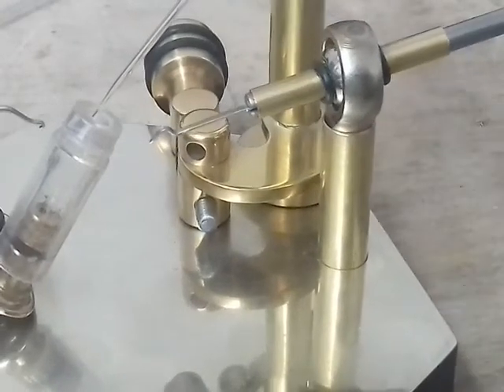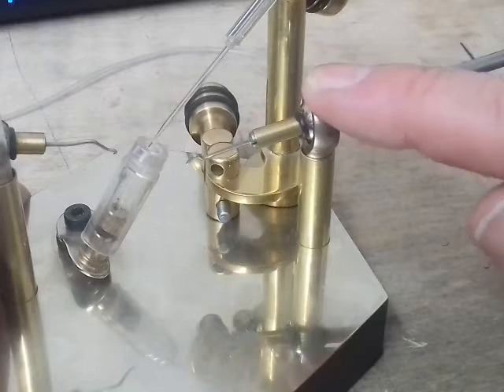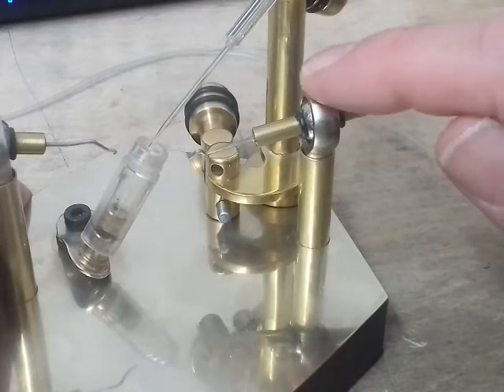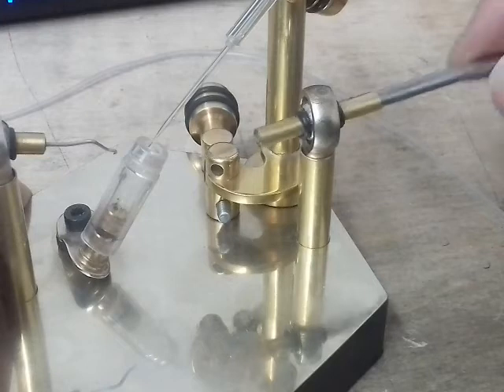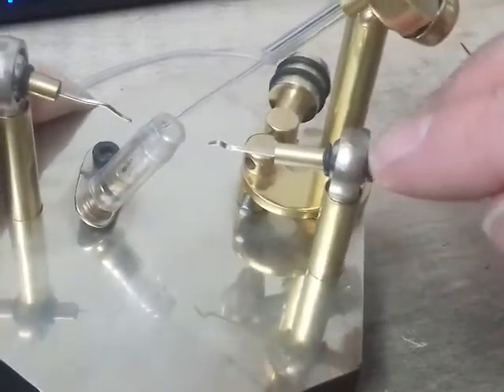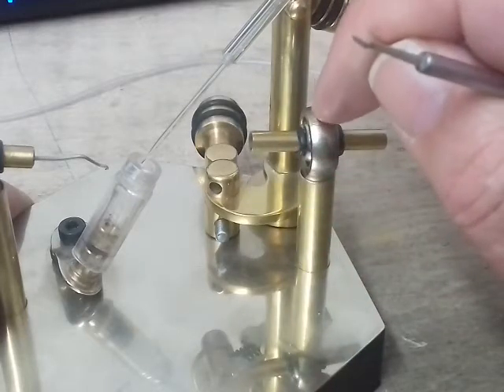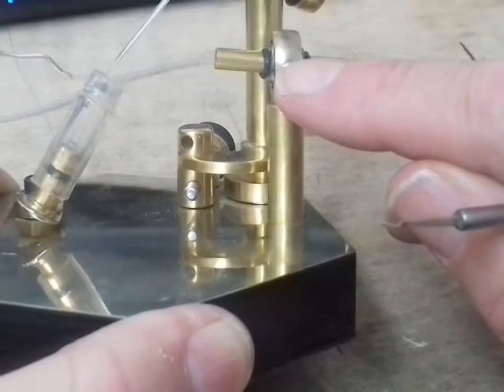Now, a lot of people have asked me whether these ball joints are stiff enough. Sometimes you get the odd one that isn't, so to tighten it up to a usable friction, simply tap that on the top there. Do it on a solid surface and just tap, tap, tap, and what it does is nip the nylon bush inside. Or if you wanted to go one step further, at the top there you can see where it's been machined. You can remove all the apparatus, turn the ball so it's sideways, so the hole in the middle is facing upwards, and drill a hole down through and tap it, and you've got plenty of room to go back. You've got a good 3/8 of an inch.